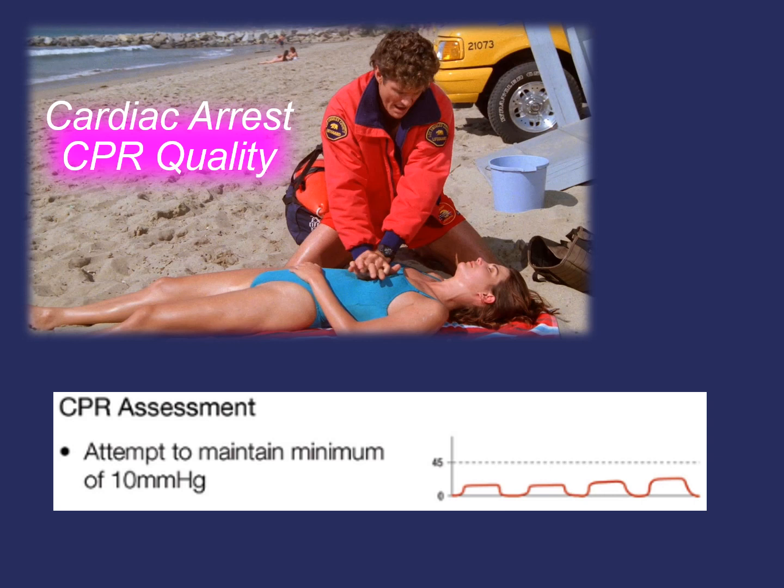When we notice the values beginning to drop, we need to troubleshoot. This is where the CPR feedback comes in and where we need to correct any deficiencies to ensure good quality chest compressions. This means ensuring compressions are proper depth, compressions at the proper rate, and allowing for full chest recoil. If all of that is effective, are you tired? Let's switch out compressors. Let's make sure that we're switching every 2 minutes at that pulse check.